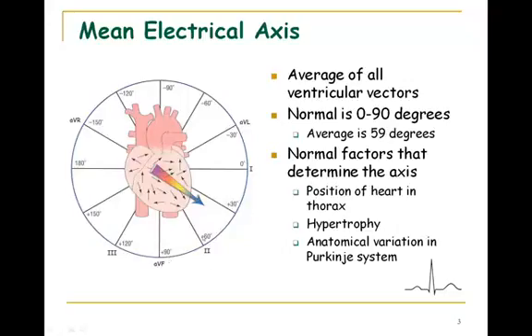But a little bit of hypertrophy, maybe if I started here, maybe shifted in one direction or the other. So the average, if they're taking like the entire population, you always say here's your Guyton numbers, the average is considered to be about 59 degrees. I'd say that's usually the average current flow is about 59 degrees. Now according to this, if I have my mean electrical axis is about 59 degrees, which standard limb lead would give me the biggest positive deflection for that QRS complex? Because this is what we're going to be using to determine the mean electrical axis.